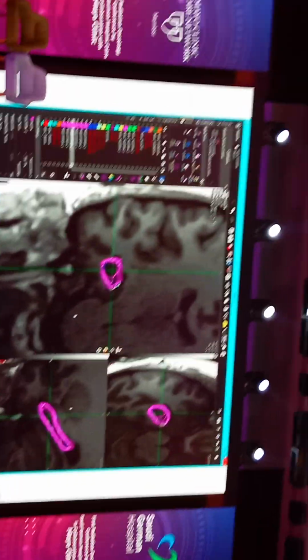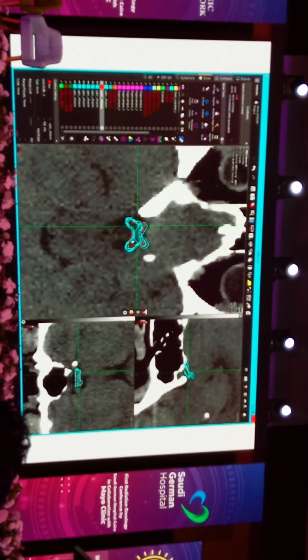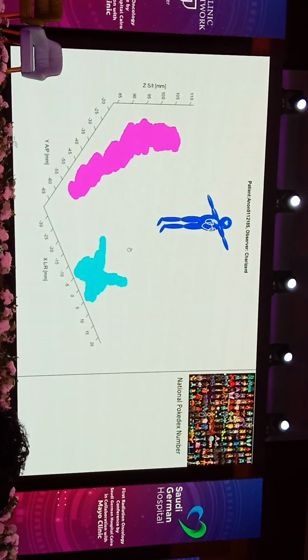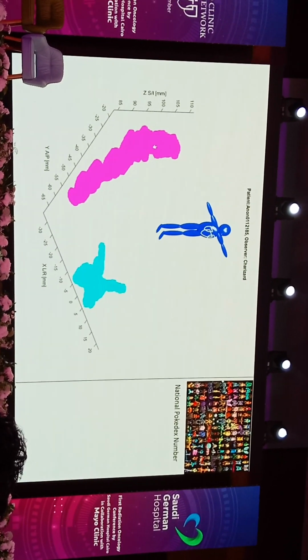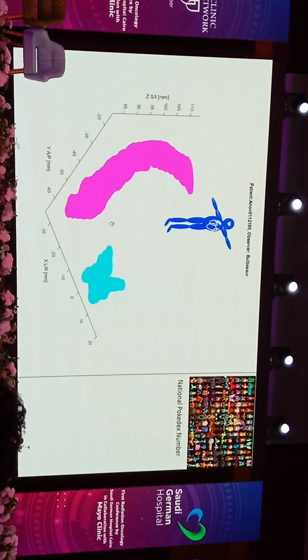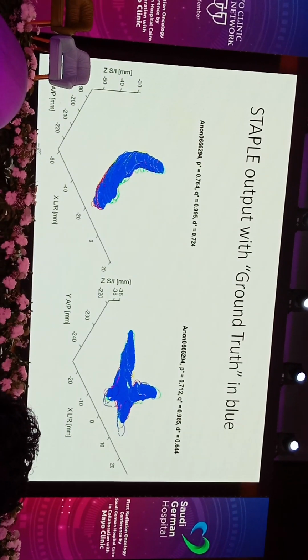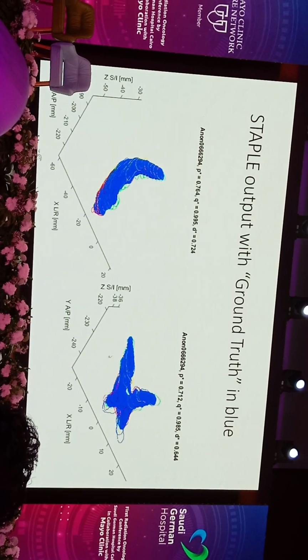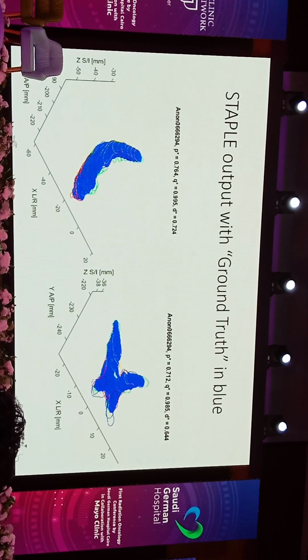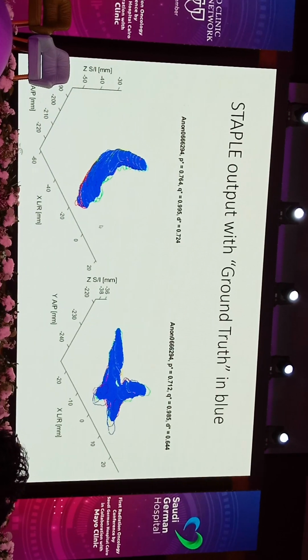And that may be different when we look at certain MRIs versus CTs. And you can see the optic chiasm similarly here. And so Doug Mosley, who you heard from earlier, has created a program where he can take these contours, represent them in space, and then overlay 2 different ones for comparison, or even multiple ones, to show that there's significant differences in the ant-post contours for the optic chiasm and ant-post, as well as medial-lateral for the hippocampi.